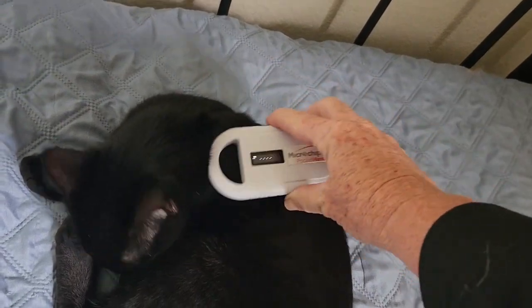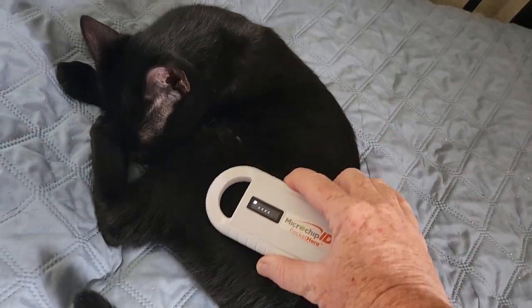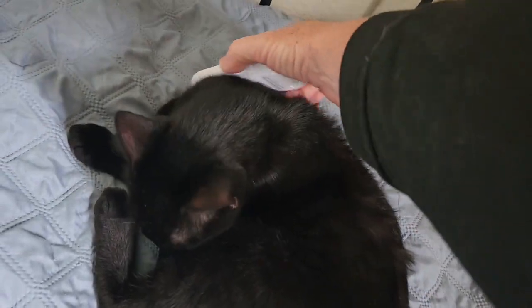The same procedure applies for both cats and dogs — go slowly and cover the whole body. I scanned a found dog recently and initially nothing came up, but I kept scanning slowly and the chip number eventually popped up. Don't be in a hurry; this isn't a magic wand — the scanner has to connect with the microchip to work. If you have more than one scanner and this is a found animal, use the other scanner to double-check that the animal doesn't have a chip.